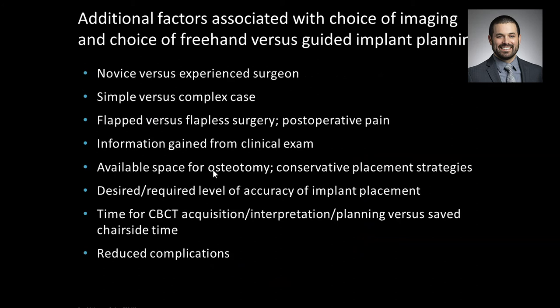whether you are dealing with a lot of space or very little space for your actual implant placement, the desired level of accuracy and aesthetic outcome, and also chairside time for the cone beam CT acquisition, interpretation, and planning versus what time you spend chairside in your daily workflow, and any avoidance of possible complications.